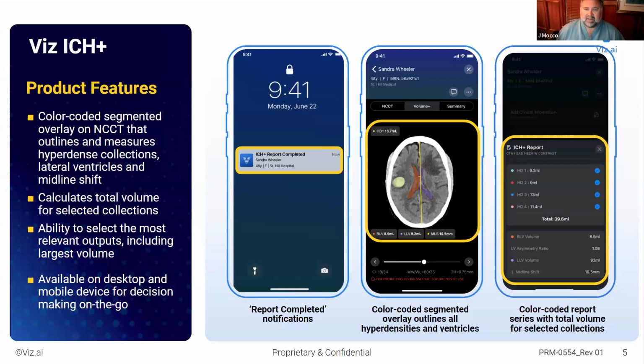Our clinical practice is 20 cc's or larger. Some people limit it to 30, but those are all things to consider as you evaluate it. I think it's very helpful that you can get these automatic measurements from Viz. Even if you want to go back and do your own evaluations or measurements, it's really spectacular to get that up front. So I think that's a win.